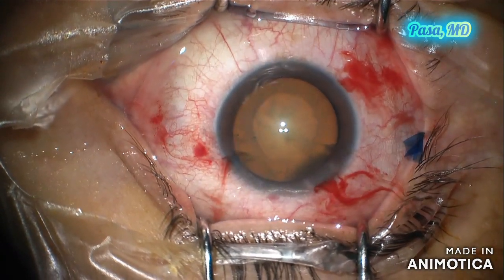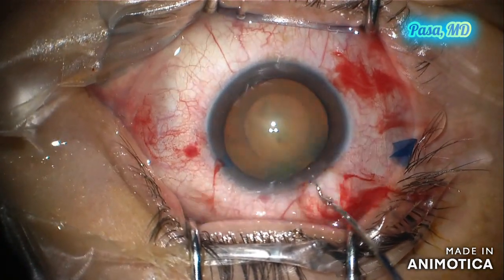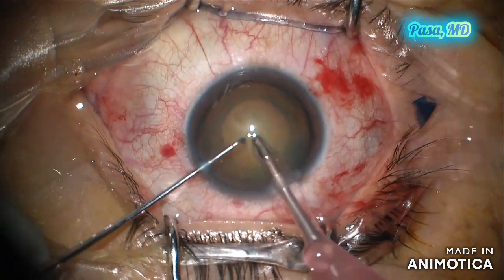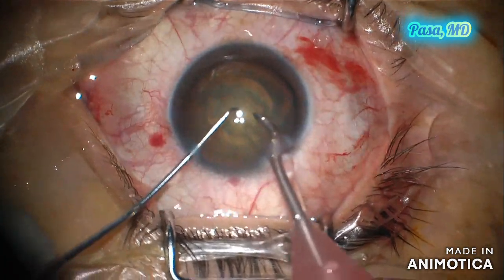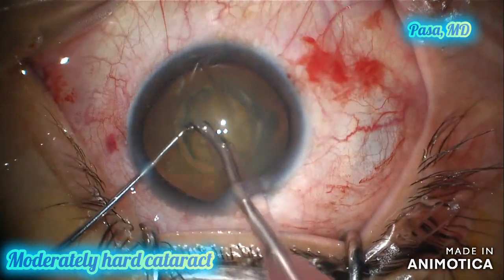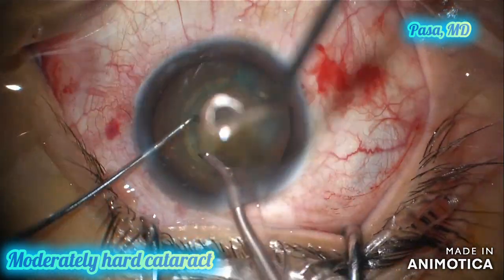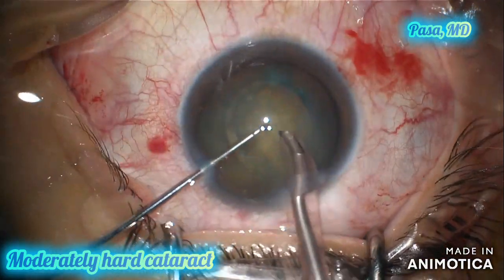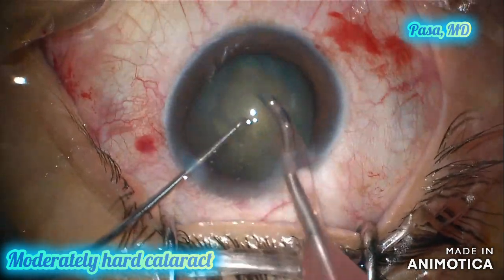After confirming you've completed the capsule access, I start developing from the center. This is a relatively moderate cataract — not too soft, not too hard. It's important to choose such a case when performing topical anesthesia for the first time. Don't go for a very soft cataract so you don't hit the capsule, and don't go for a super hard cataract so you don't have difficulty cracking the nucleus.